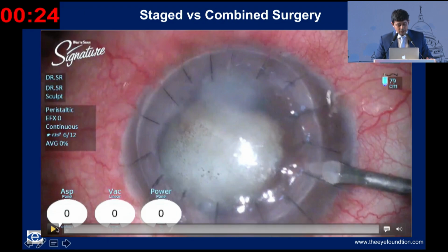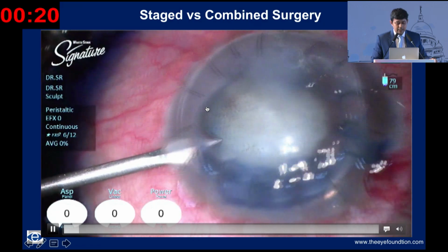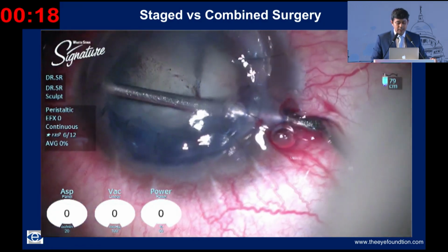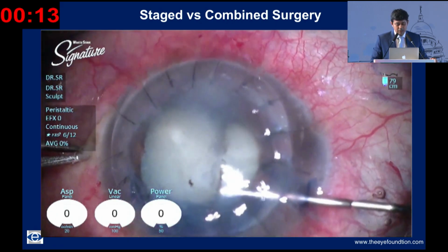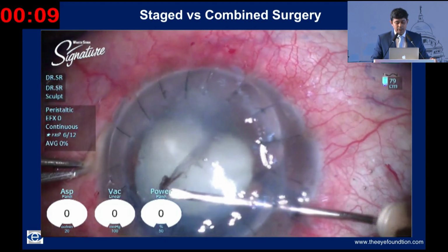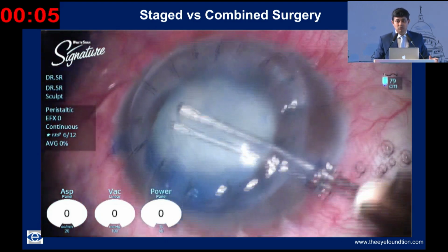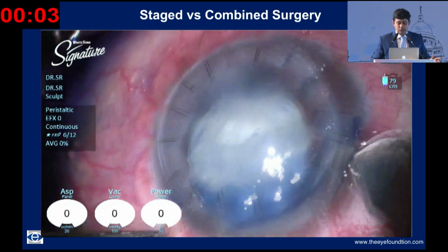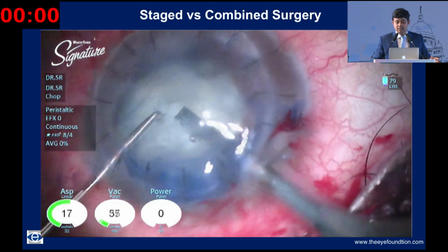This is another situation where the patient, after a therapeutic graft, had an intumescent cataract, 360-degree synechiae, and high IOP, which was leading to a corneal edema. Originally, I thought I may have to do a combined surgery. But as I was doing the surgery, I realized once I decompressed that the corneal edema was coming down. It was also partially IOP induced. It was early postoperative period. And I just went ahead with a plain cataract surgery in these cases.